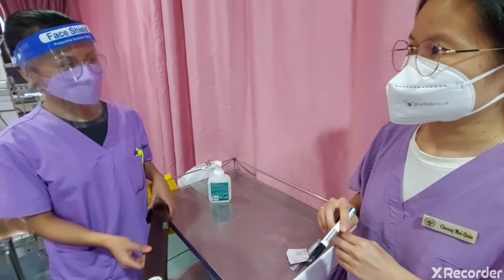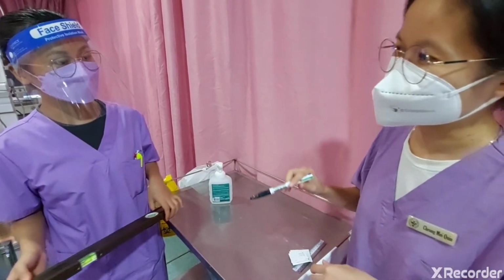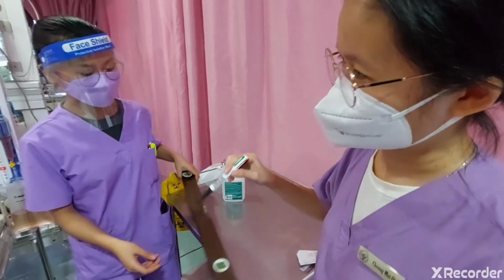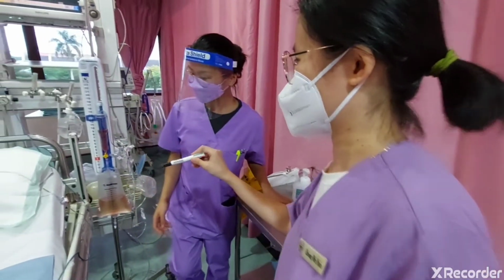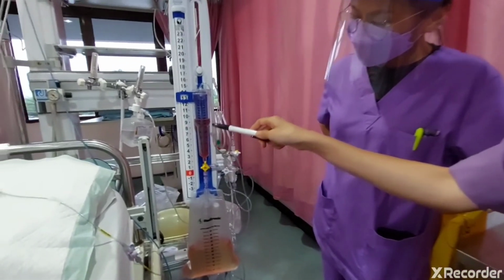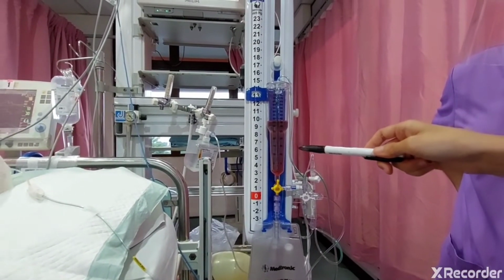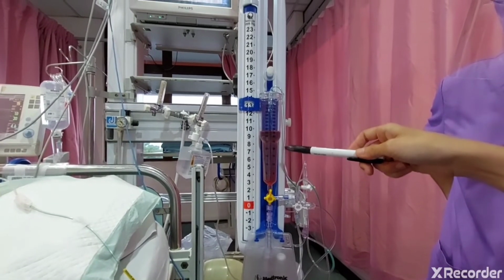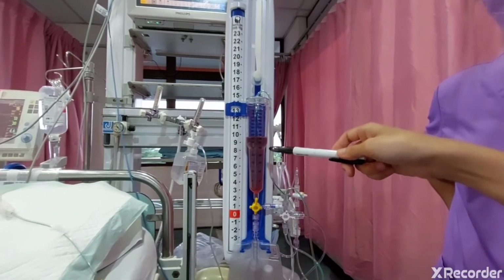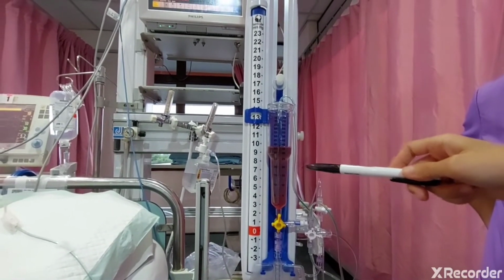What are the abnormalities? Any things to observe? We see this chamber. We need to observe the consistency of this CSF, whether it's heavily blood stained or any cloudy color. If cloudy, it means infection, so we need to inform the doctor. If hemorrhage, it means there's some bleeding, so we need to inform the doctor immediately.